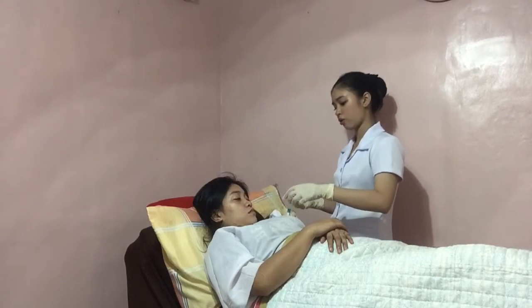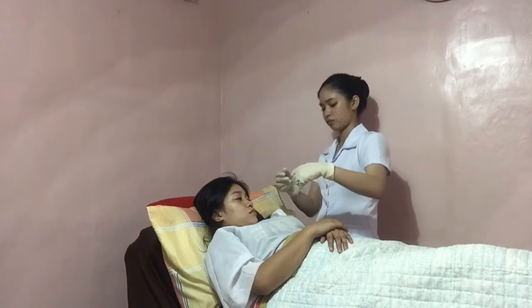So the electronic thermometer indicates the complete reading through light or tone. So Althea, I'm gonna remove the thermometer now. So you have 35.7 degrees Celsius.